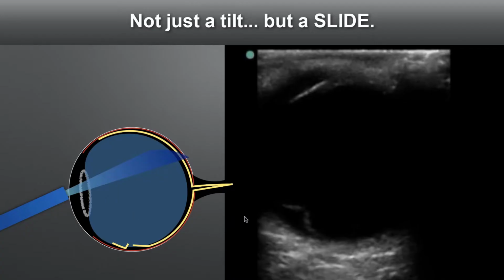However, if you want to get those couple of extra percentage points, things that you can do are get a better exam of the eyeball, because not all retinal detachments are super easy to see when you first put that probe on. If you just tilt the probe up and down, you'll really only see the posterior 1/3, maybe 1/2 of the eye.